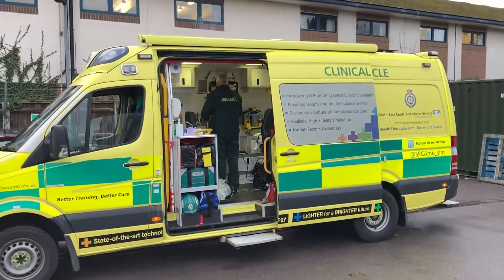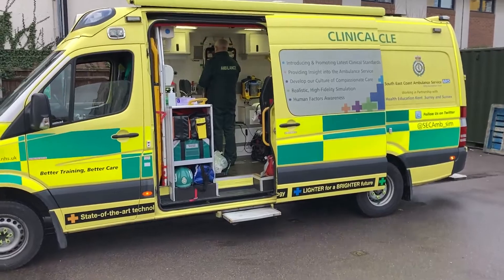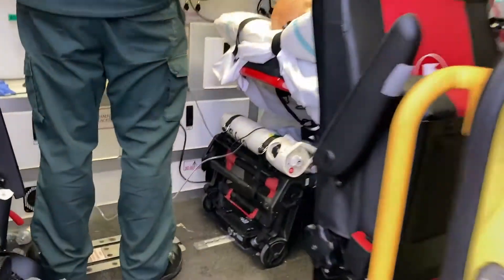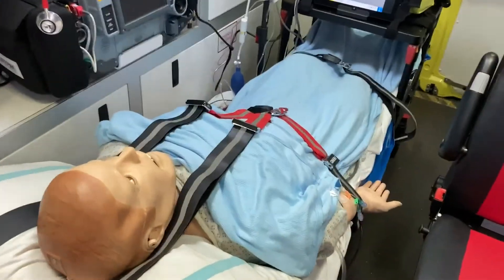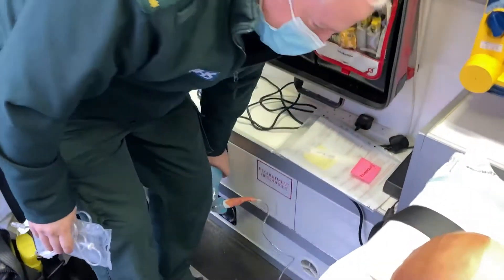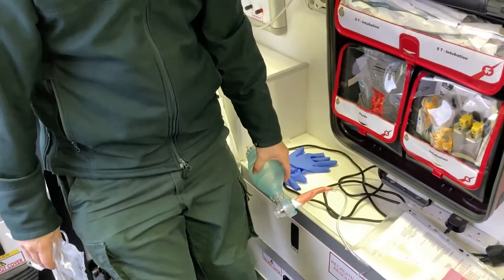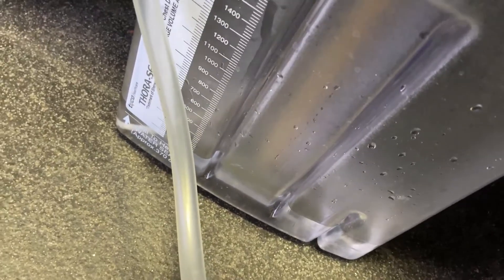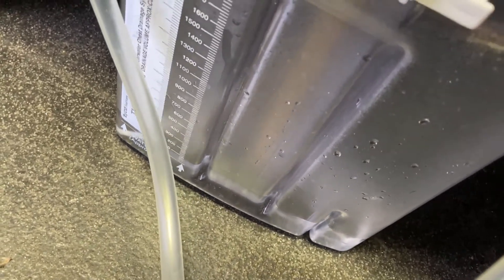So here's the outside of the Symbulance, let's go in and have a look at that chest drain. Here's our sim man and as you can see underneath the sim man we have the chest drain which looks like a normal chest drain. Mark from CCAM has a little bag valve mask that he's going to squeeze, and when he squeezes it — if I zoom in closely — you should just be able to see and hear bubbles.